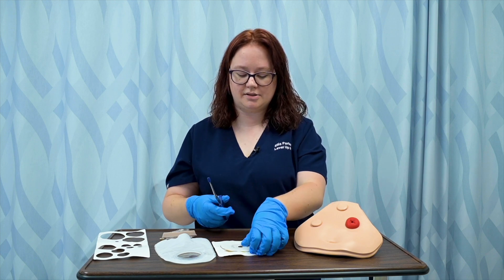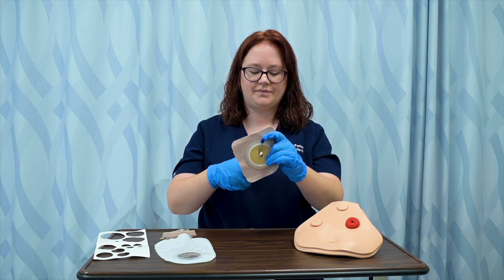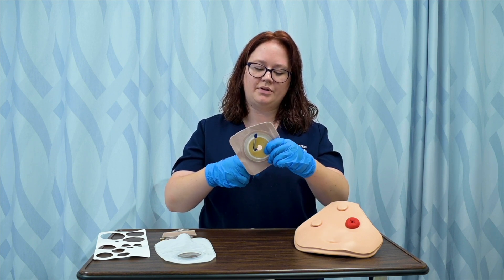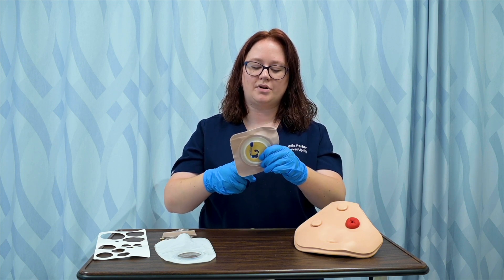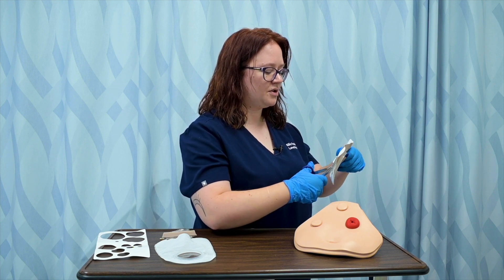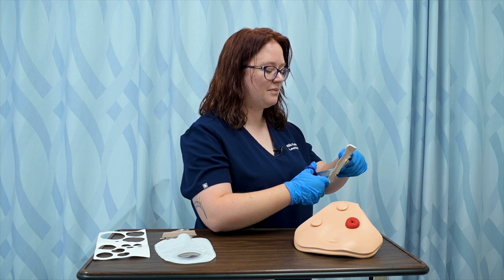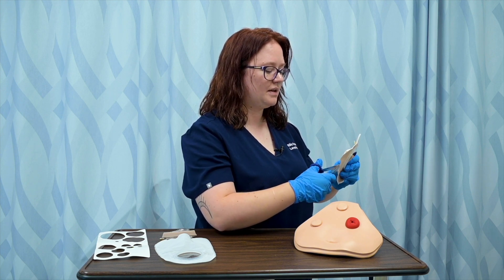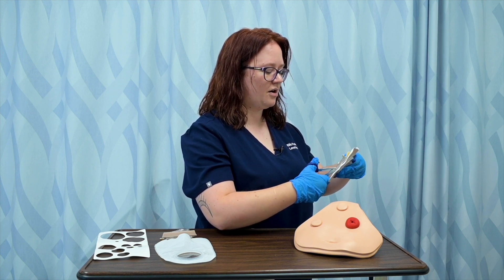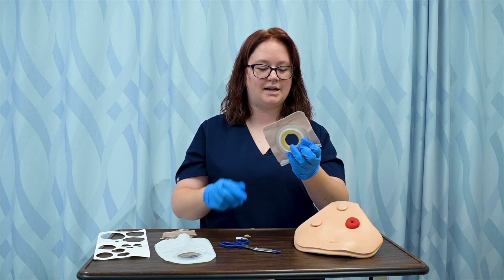I'm going to get some blunt tip scissors and I'm going to cut that circle out. If my patient is capable of helping with these tasks, it's always important to get them involved so that they can do this when they go home. We want to make sure that they or their caregiver or loved one is able to provide these services after they leave the facility. I've got my appropriately sized ostomy hole.